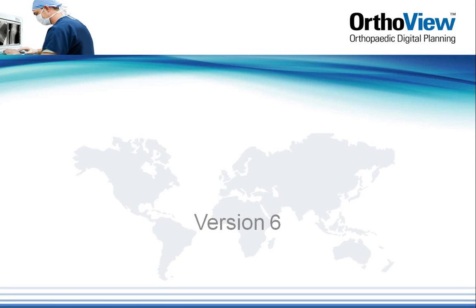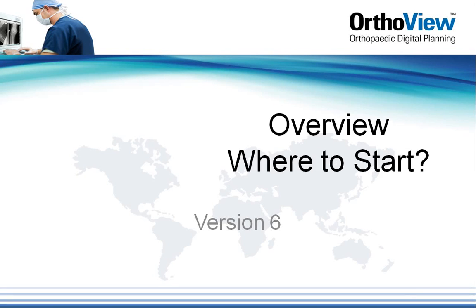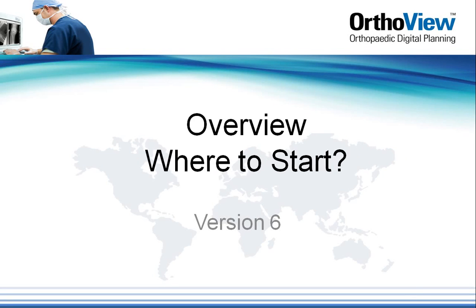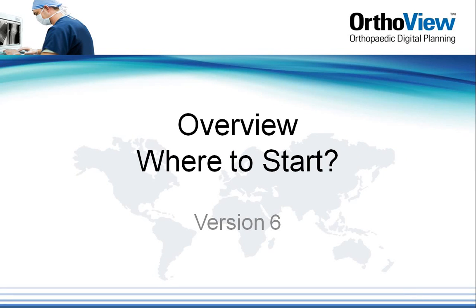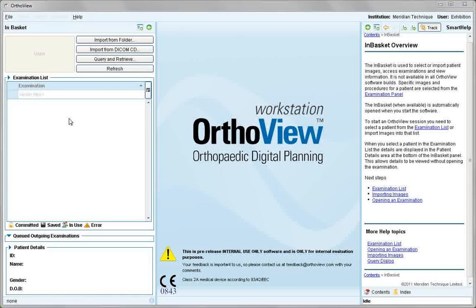Welcome to the OrthoView video tutorials. To begin, there are two main inputs to the OrthoView software: one is images and the other is templates.